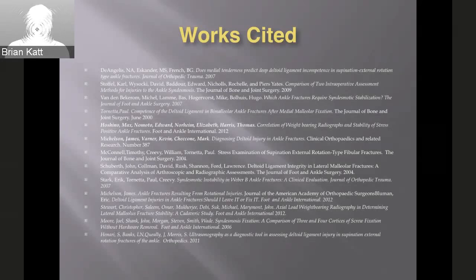One thing from our residency, and what Green does too, is that our guy who did trauma and then foot and ankle was very cost conscious, and he said the 4-0 cannulated screws, that's like an extra $500 in cost because the cannulated drill bit is very expensive, and we can't bill that.